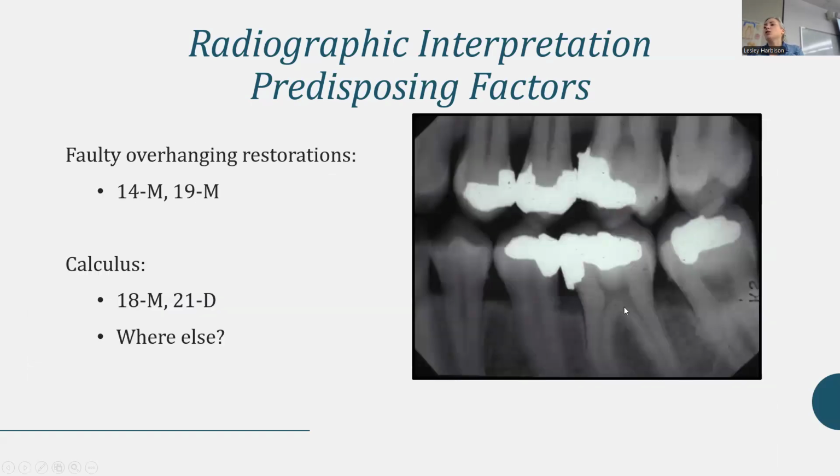Faulty overhangs, some more just giant overhangs. You're going to scale that and just come to a wall. You just hit a wall. And if it's a small overhang, you can actually smooth it in clinic, and you should. But if it's an overhang like that, the filling just has to be redone.